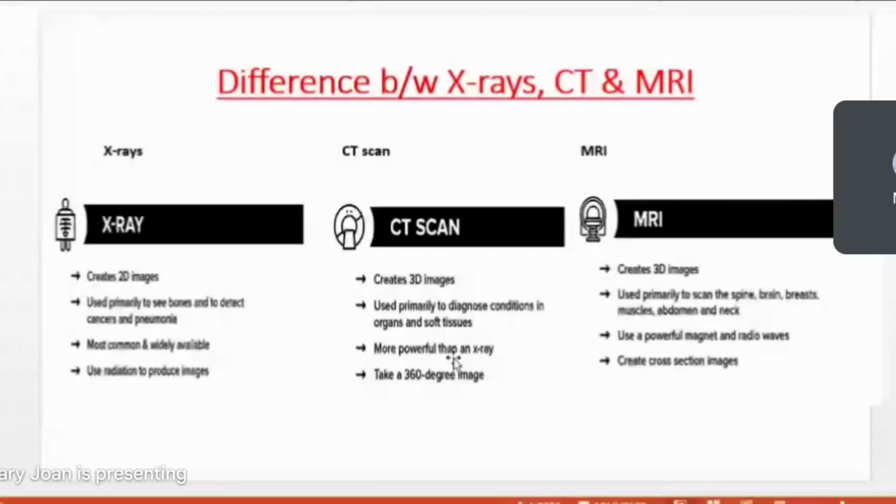identify that. So similarly, when tumors are there, when swelling is there, inflammation is there, all those things, whether it is a swelling, or an inflammation, or a tumor and inflammation surrounding it, all this information can be more clearly understood from an MRI image. So soft tissue delineation is much better with MRI. And we have seen how the MRI images are acquired. This also gives us cross-sectional images and 3D information. And another thing is there is no use of ionizing radiation.